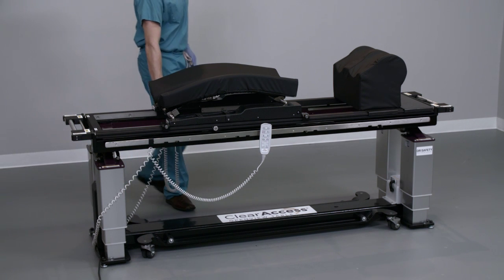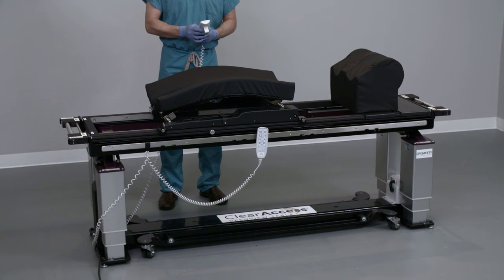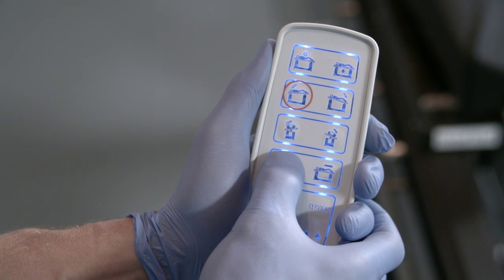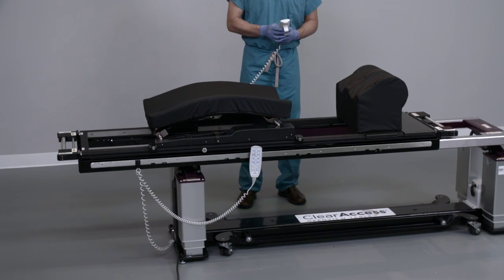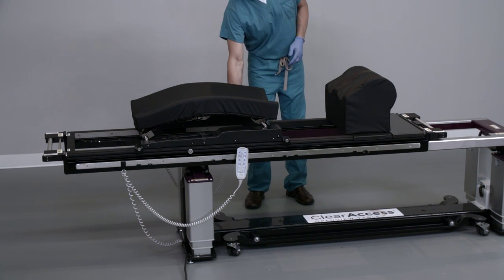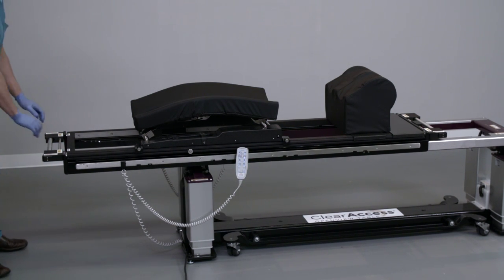To prepare the table for posterior spine cases that require cranial stabilization, fully extend the cantilever of the table by pressing and holding either the cantilever extend or the cervical button on the hand controller until the table stops moving. Once the table has been fully cantilevered, extend the handle at the head end by grasping and pulling the handle outward. Ensure that it is locked in the extended position.